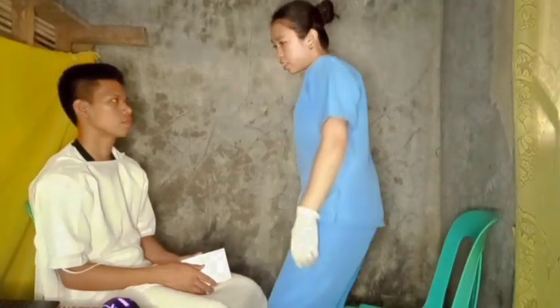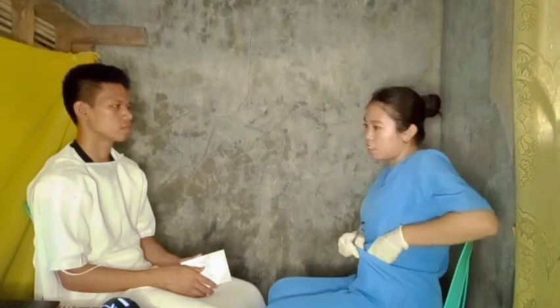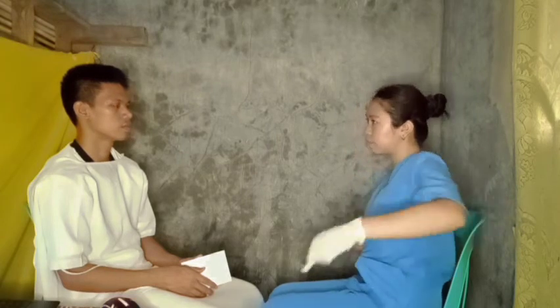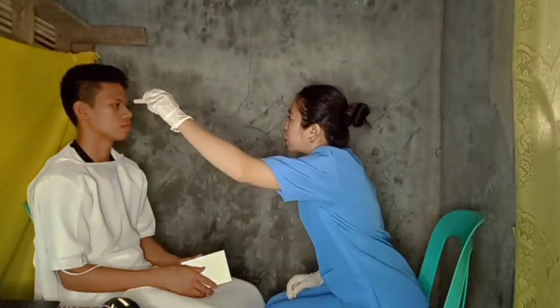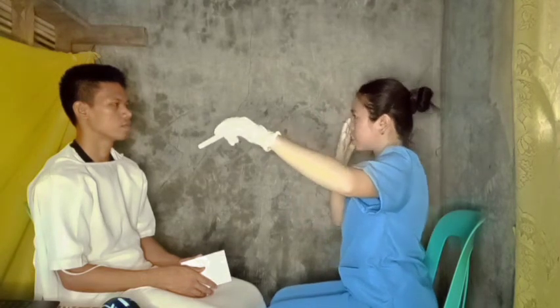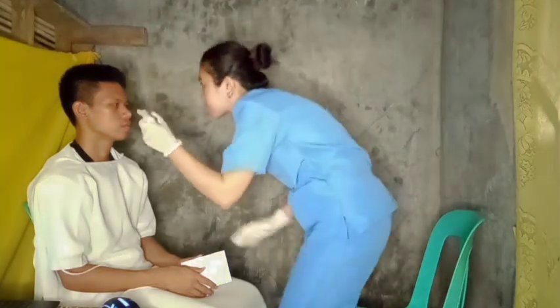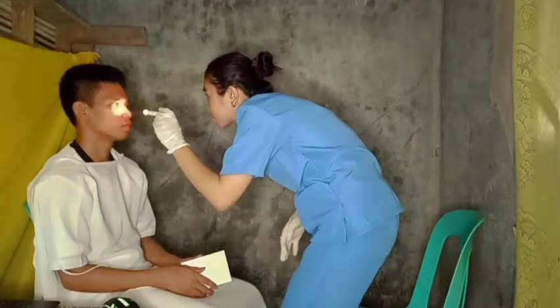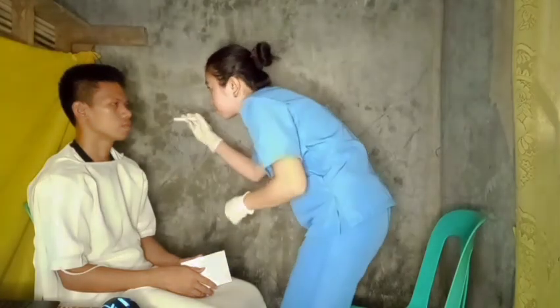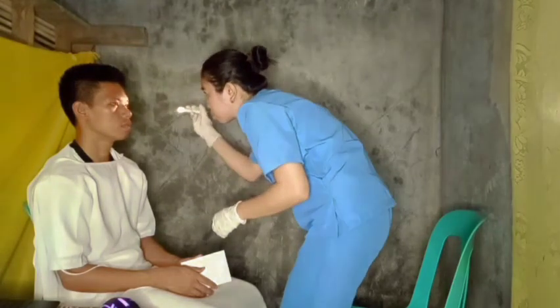Excuse me, sir. So Sir JM, kindly look at a distance. At a distance, sir, here. Okay, sir.